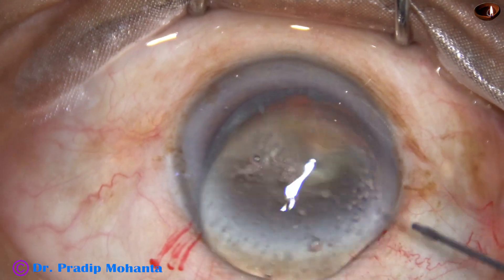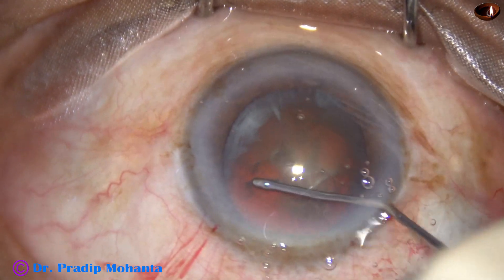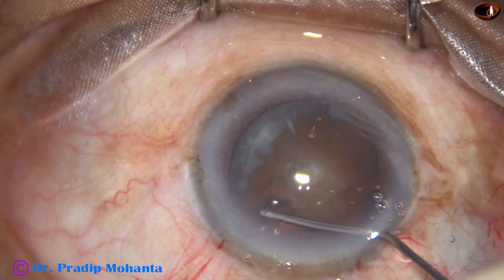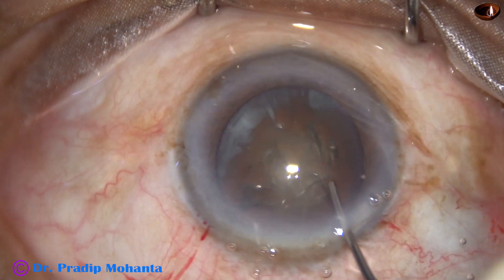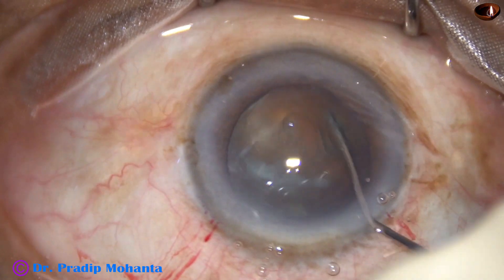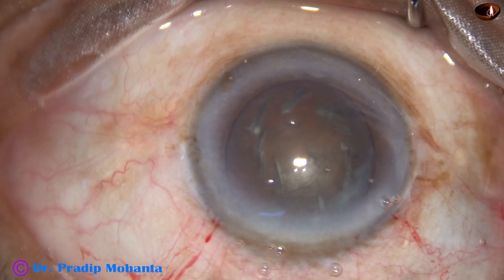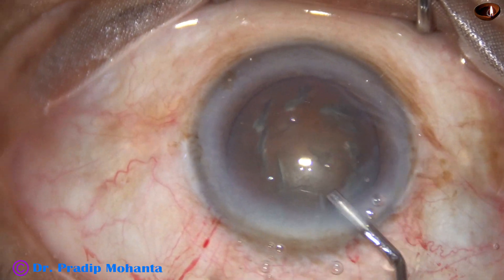Hydrodissection is done at multiple points. Small amounts of BSS is injected at multiple points and the nucleus is rotated. Viscoelastic is again injected to fill up the anterior chamber.